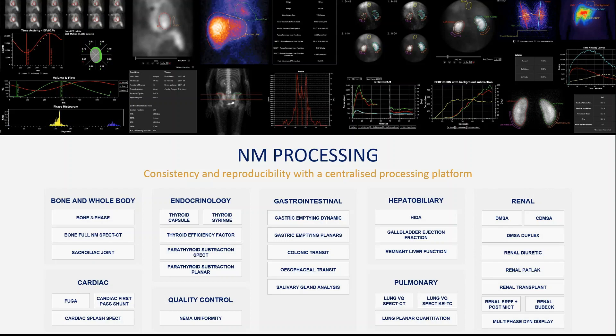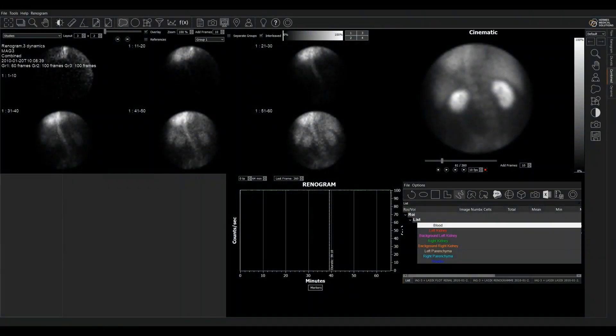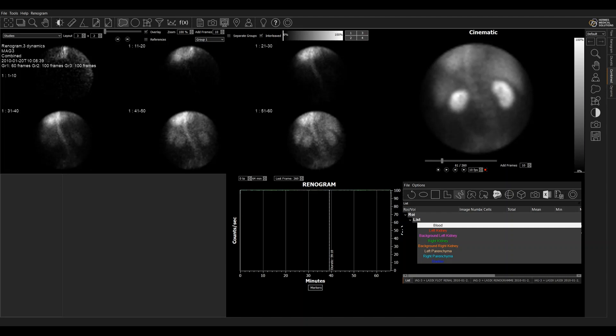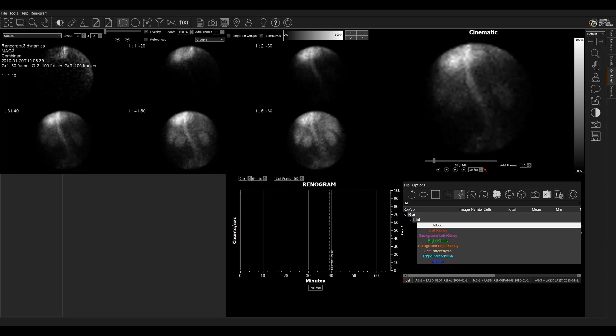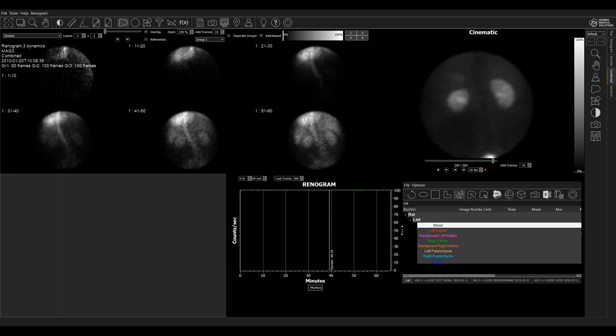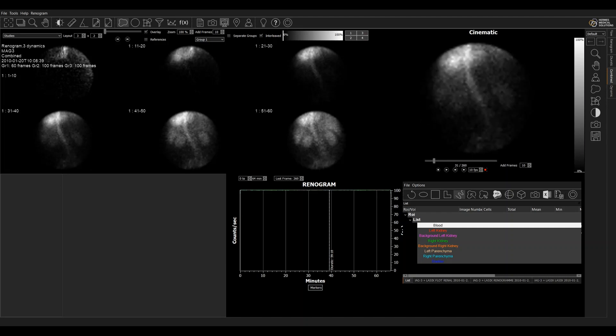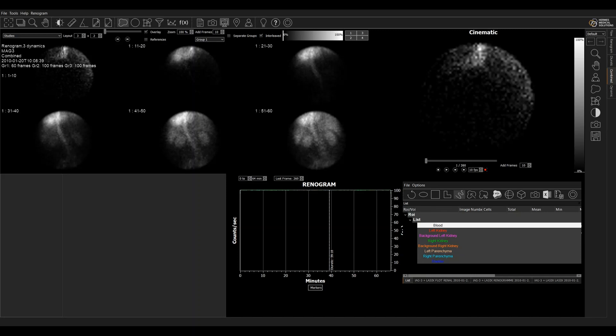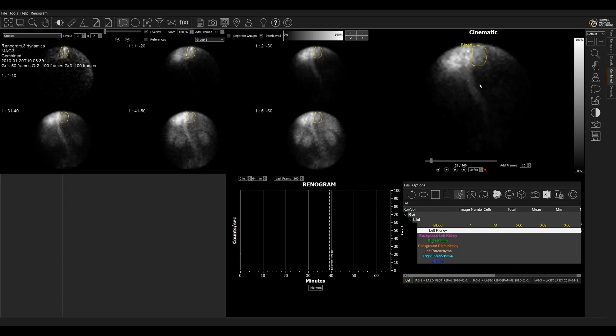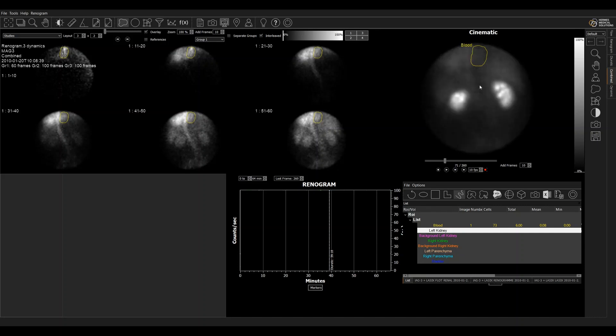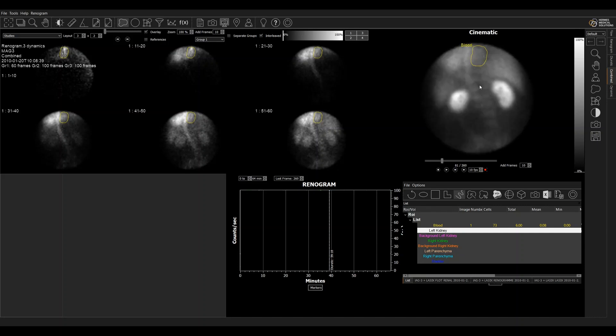Looking now at the renogram analysis options. So we have loaded here a dynamic renogram. I'm going to start by drawing the blood regions. I'm just going to place that there, clicking and dragging to make the region. So now we'll draw the left kidney.